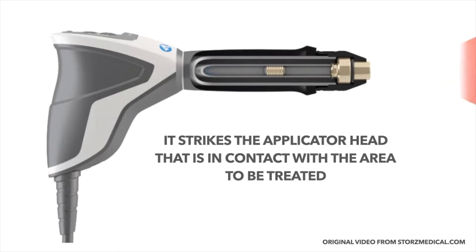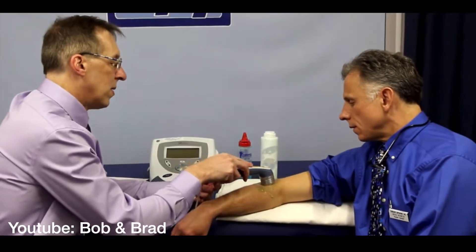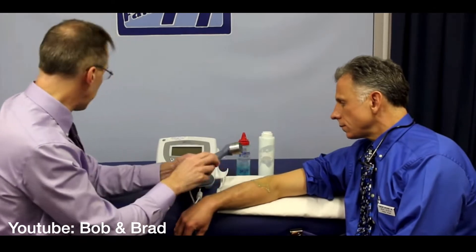These sound waves are very different to ultrasound, which is a modality that a lot of people are familiar with, where that machine causes just a gentle warmth in the skin. These shockwaves are quite a high-energy sound wave and they cause mechanical stimulation over the tissues being treated. There are a number of changes that happen within the cell and tissue, and one of the big ones when treating tendons is an increase in fibroblast turnover. Fibroblasts are the cells that lay down collagen to help repair and rebuild damaged tendons.